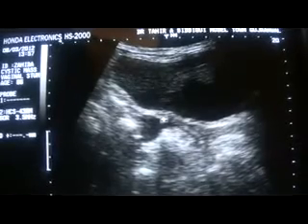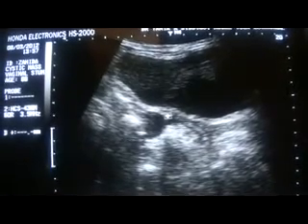This is a magnified view. Here is the vagina; there comes the cystic part with solid element. So this is a complex cyst — a pelvic cyst relating to the vaginal stump as per my impression — and it has cystic and solid components in which the cystic component contains low-level echoes.